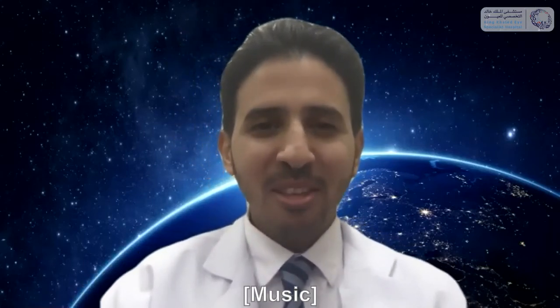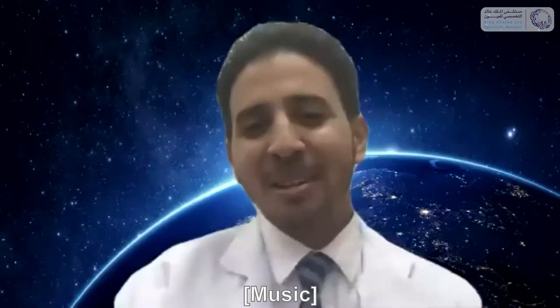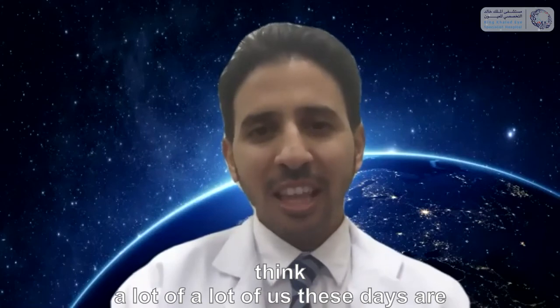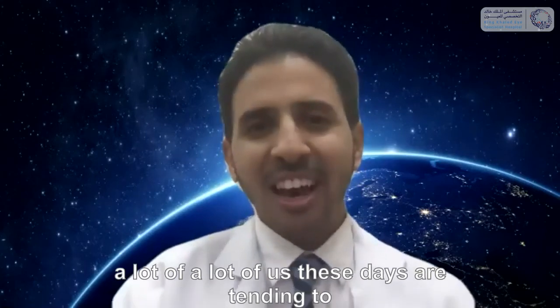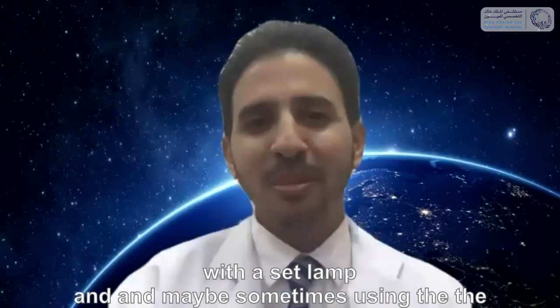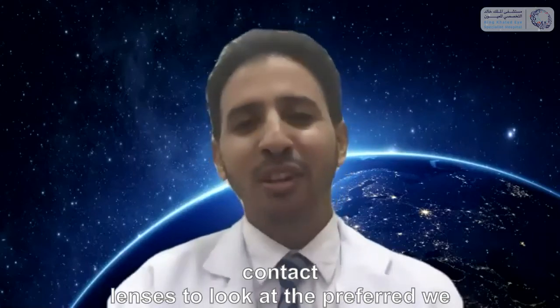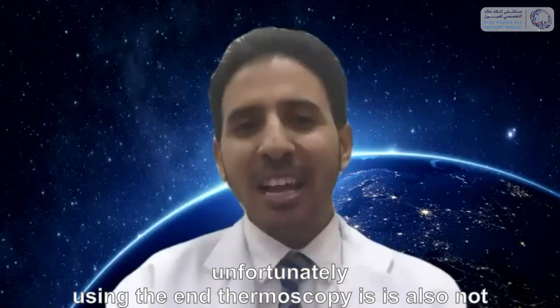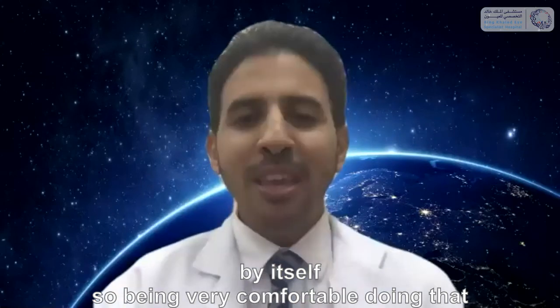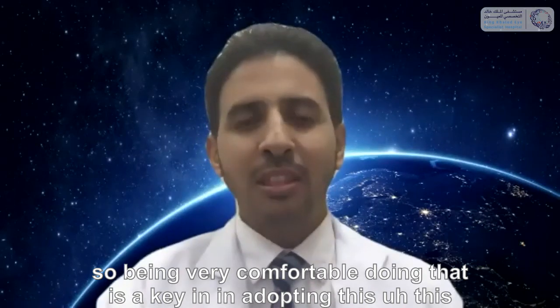I don't want to show you in an old fashioned way, but the reality is when I started my fellowship, and I think a lot of us these days tend to use the 90 diopter lenses with a slit lamp, and maybe sometimes the contact lenses to look at the peripheral retina. Unfortunately, indirect ophthalmoscopy is also an art by itself. So being very comfortable doing that is key in adopting this procedure.